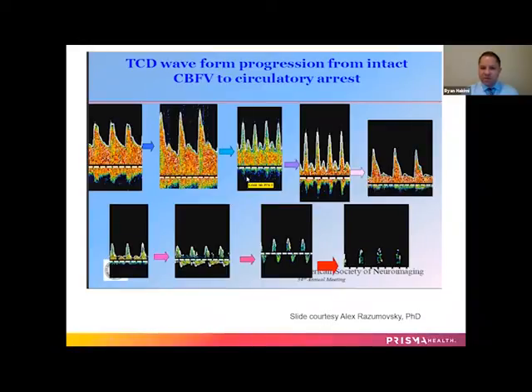And then as the patient progresses from, in this example, anoxic brain injury, as they're building up the cerebral edema, you can see that the waveform morphology changes, and you ultimately get to a point where you're seeing reversal of flow in diastole, meaning in this image here, the heart contracts in systole, blood goes up to the brain, and because the ICP is so high in this given individual, the blood rapidly comes down and in fact refluxes back down outside of the skull, and then again it goes back up.